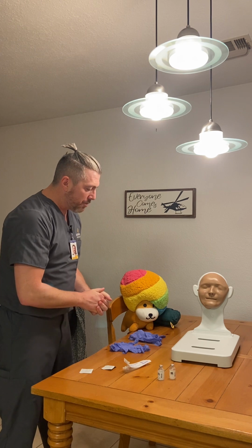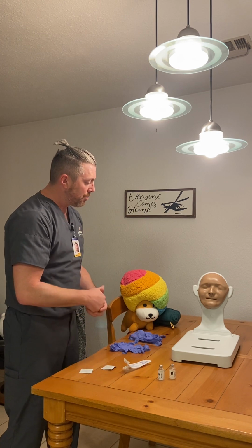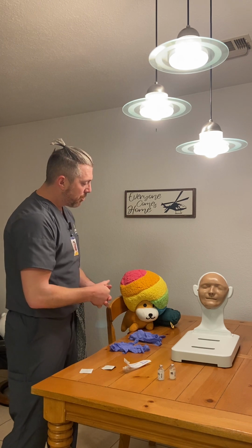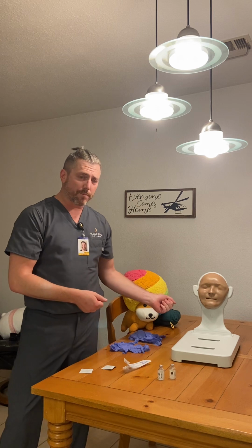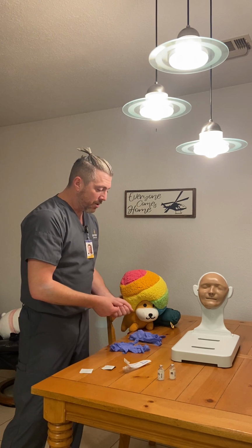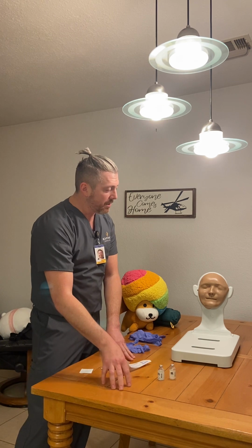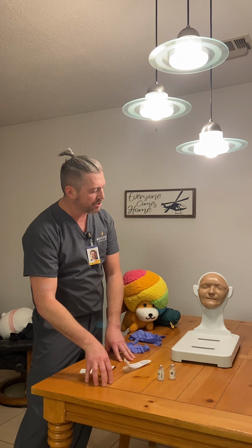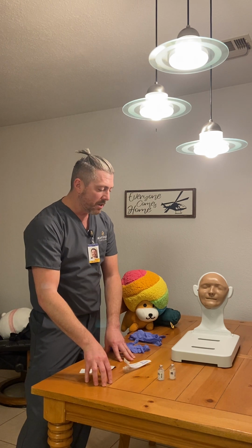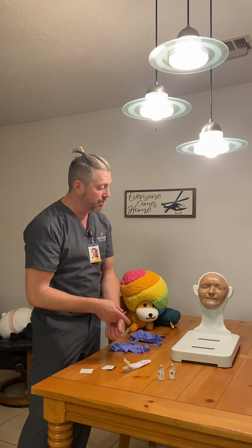Hi there, nice to meet you. Doctor's ordered some insulin for you today. Do you have any allergies? No allergies, no food, no medication, none of that? Okay, great. We'll check the blood sugar. Blood sugar is 150. All right, so doctor's ordered two types of insulin. We've got a short-acting and a long-acting insulin, and we're going to be combining them into one syringe and give you one injection.